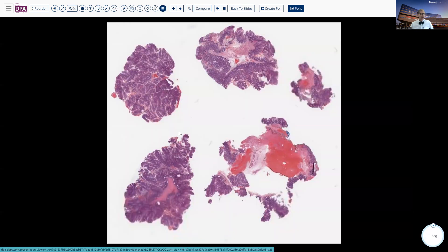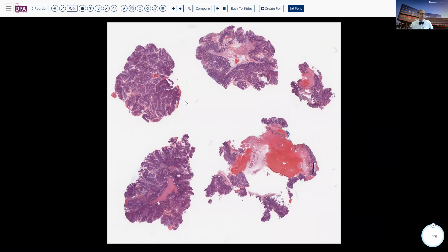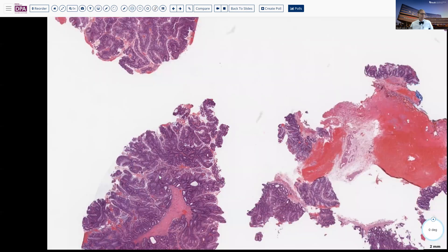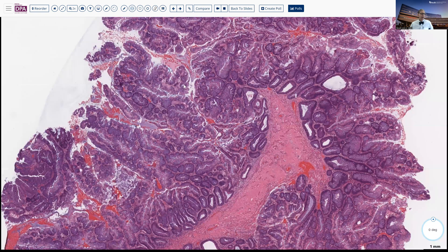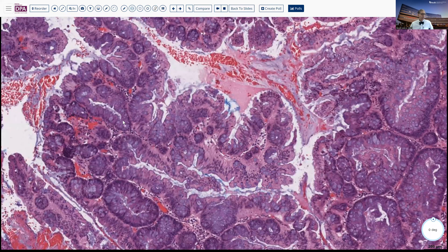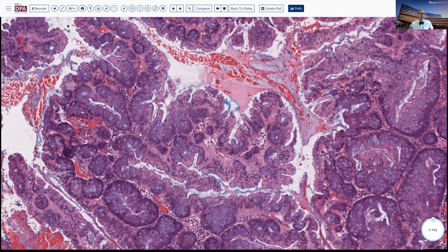Here's another example of the traditional serrated adenoma. We can see there are nice long villus-type structures — they're very busy, very filigreed, very branchy and complicated. And you can see again these numerous ectopic crypts, these little budding-down areas with typically some mucin cells right beneath the surface.